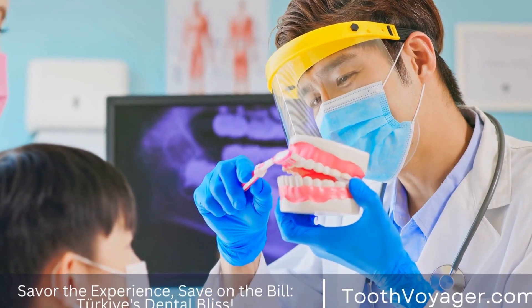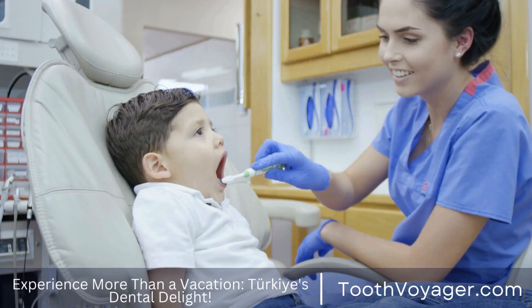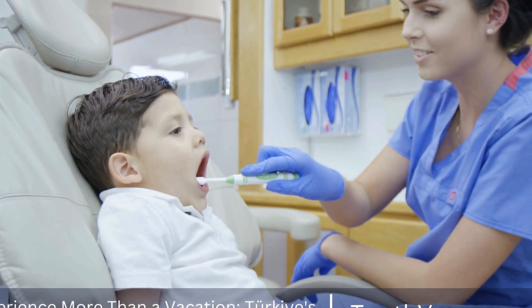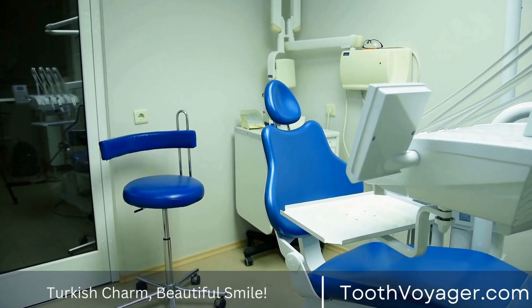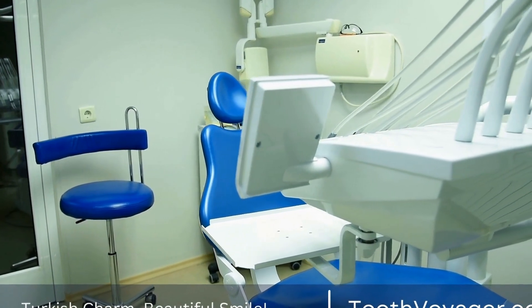Dental bridges are the most common procedure in dentistry used to repair any missing tooth. It's a permanent dental restoration which is fixed to the natural teeth on either side of the gap created by the missing tooth. This video outlines the steps to obtain a dental bridge, including the initial consultation, preparation of the tooth, and installation of the bridge.